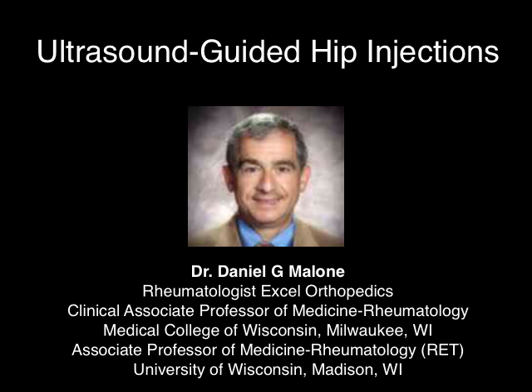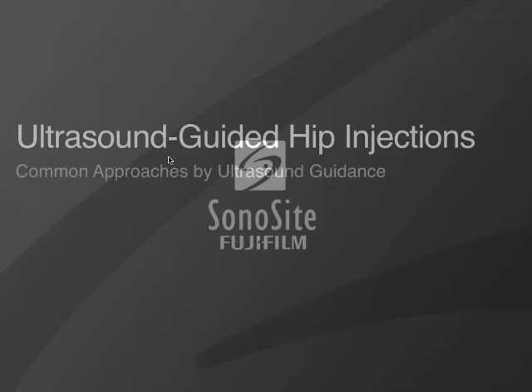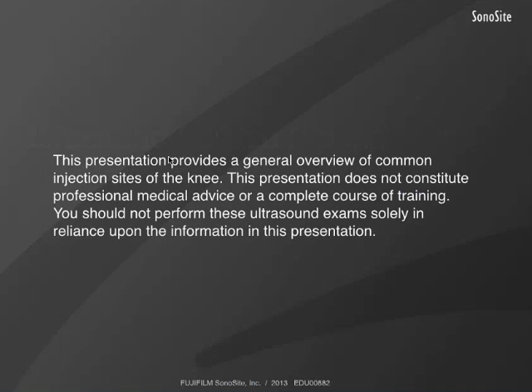We are going to do a short treatise here of hip injections on the various structures of the hip that are important to know for good patient care. These are all going to be ultrasound guided, and we're going to use the most common and easiest approaches to make your life and the life of your patients that much easier. It's a general overview. We aren't giving medical advice. This is a pretty typical disclaimer.